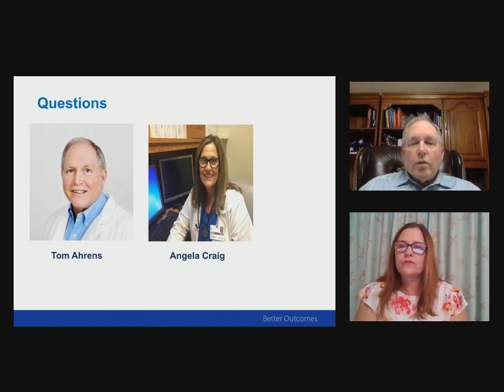So you can use it to make an assessment of a new patient, but you can also use it as a monitoring tool. Like I said, if I go on a rapid response call, I'm bringing a capnogram because it's going to tell me so much right away. And like I said, if I have an end tidal of 30, it rules out pretty quickly any acute pulmonary or cardiac problem.